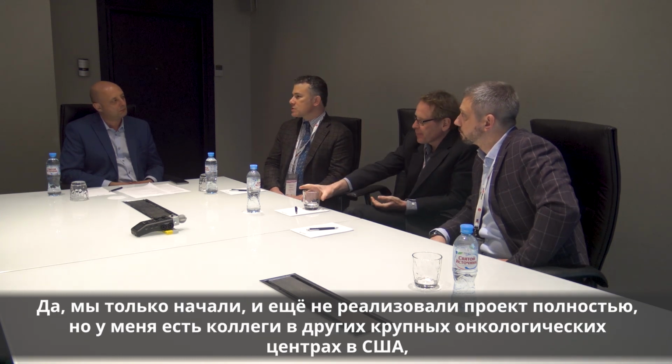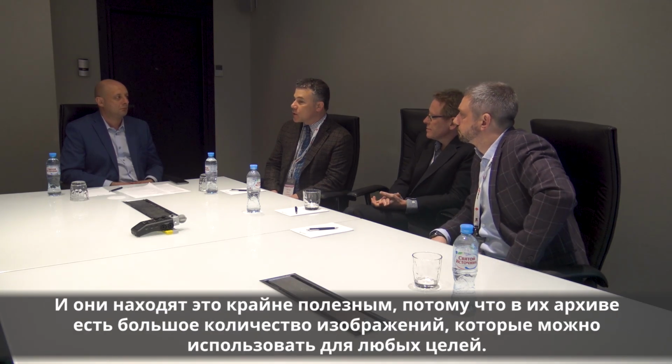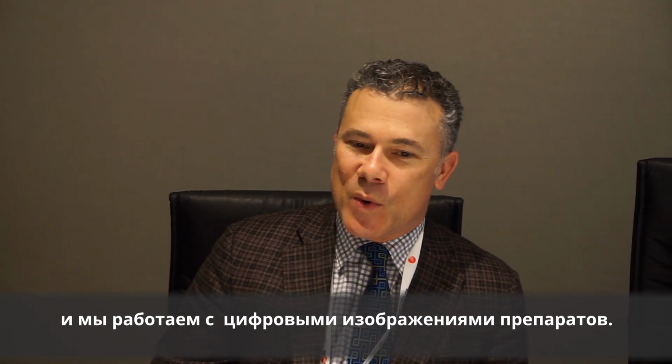Yeah, we're actually just starting. We haven't implemented it yet, but I have colleagues at other major cancer centers in the United States where they're doing all the tumor boards now by whole slide scans. And they find it incredibly helpful because there's always an archived whole slide example from which they can pull for any applications. And we have so many cases that are sent in for consultation because patients are being referred from smaller institutions to a tertiary or quaternary cancer center where the initial slides did not originate at our institution.